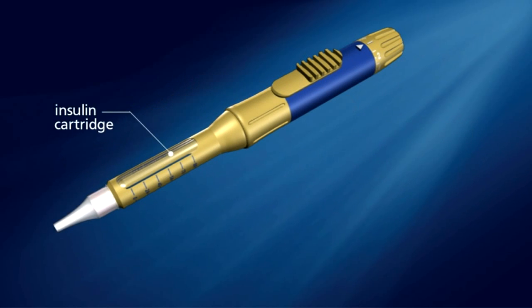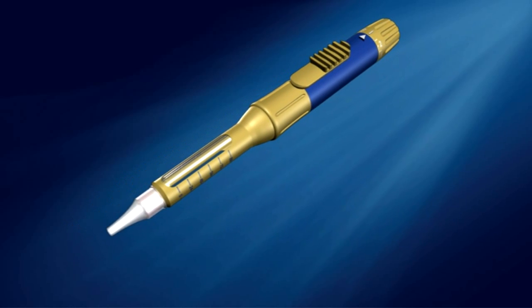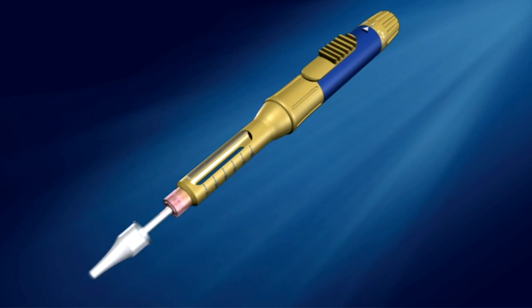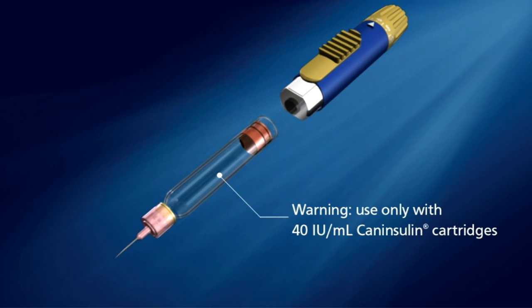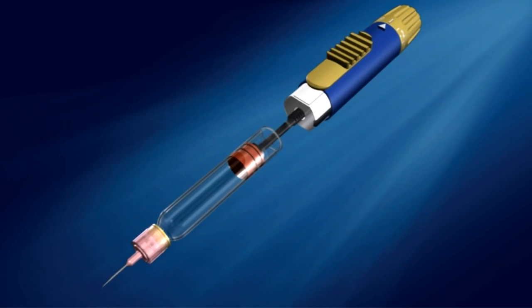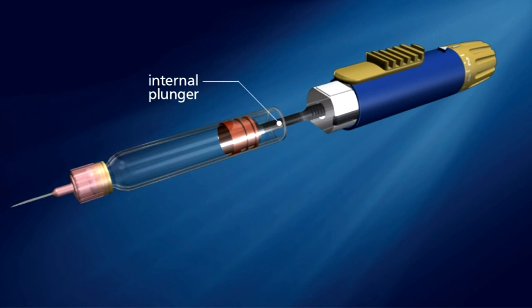The insulin cartridge allows you to administer multiple doses. When all the insulin has been used, simply remove the empty cartridge and insert a new one. Please note that VetPen is designed only for use with cartridges containing 40 international units per milliliter of Caninsulin manufactured by MSD Animal Health. When you push the release button, the internal plunger pushes the small red stopper at the end of the cartridge to expel the selected insulin dose through the needle.